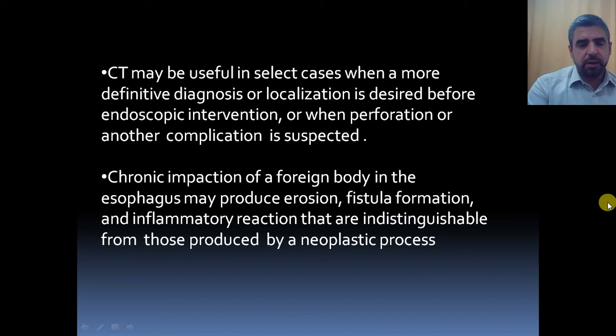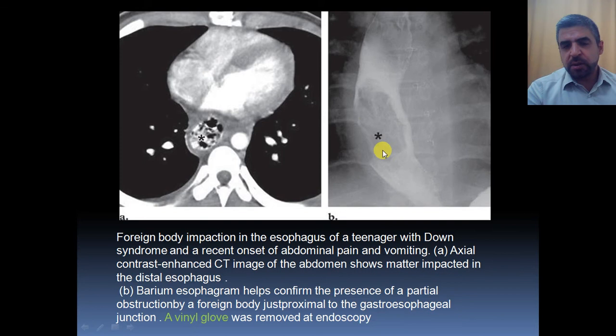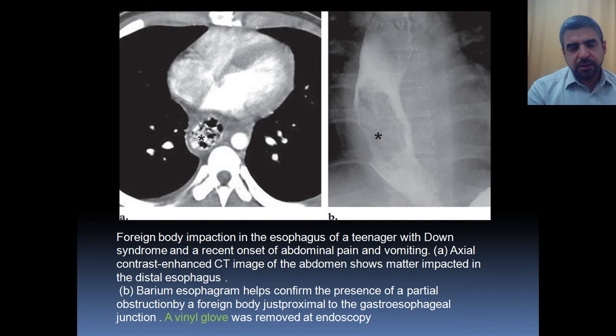For example, you can see here a foreign body impaction in the esophagus of a teenager with Down syndrome. There is something within the esophageal lumen containing multiple air bubbles and oral contrast retained within it. After endoscopic retrieval, it appears as a filling defect within the lumen of the esophagus with no signs of perforation or leak. After endoscopic retrieval, it turned out to be part of a vinyl glove, because the patient has intellectual disability — it's a case of Down syndrome.